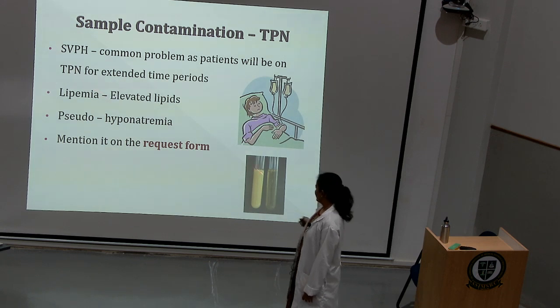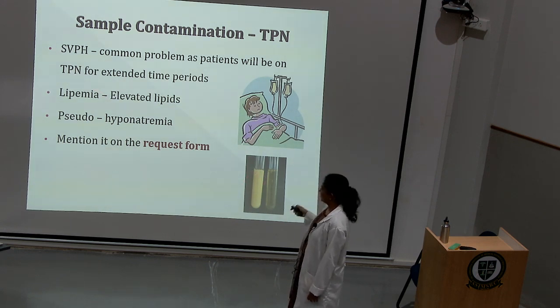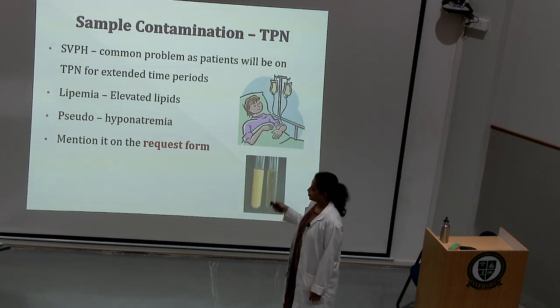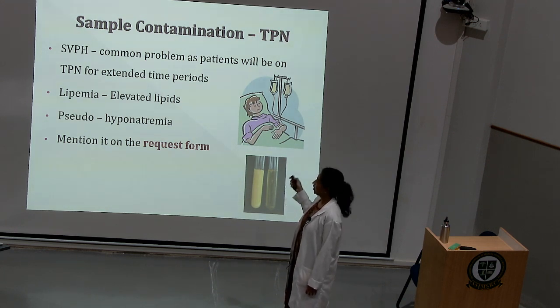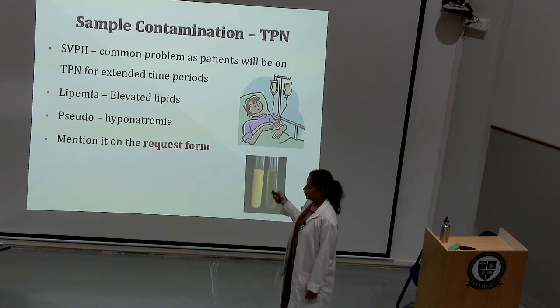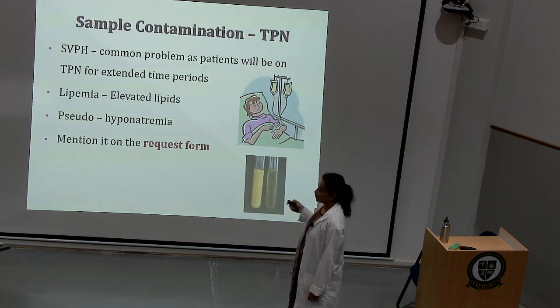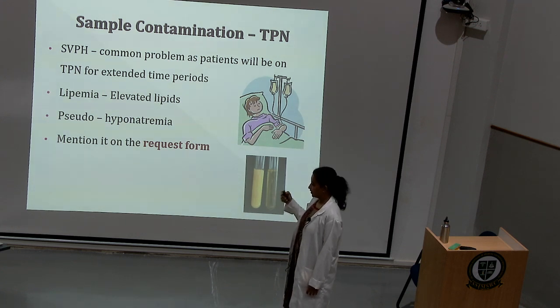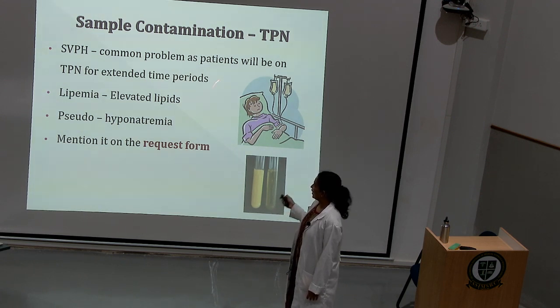Contamination from total parenteral nutrition can cause lipemia, which interferes with the analysis of most chemistry analytes and can also lead to pseudo-hyponatremia. Total parenteral nutrition means nutrition is provided through a parenteral — intravenous — route for patients unable to take oral feeds, such as comatose patients. If you are collecting samples from such patients, you need to mention it on the request form. There can also be possible contamination of the sample with bacteria, which is relatively uncommon.